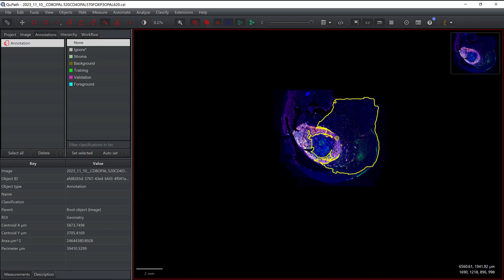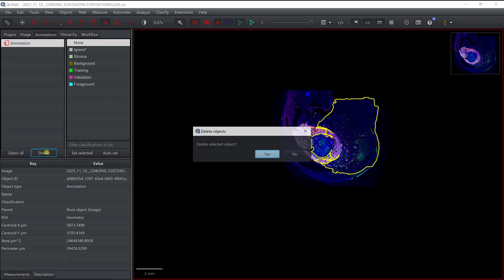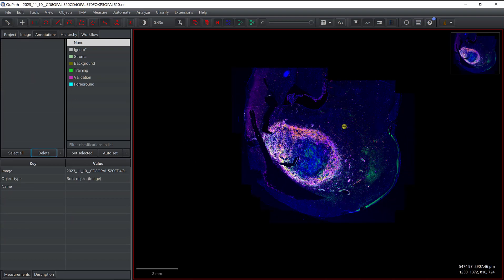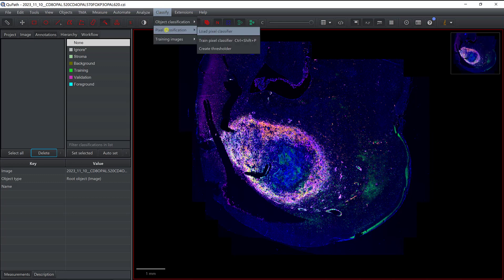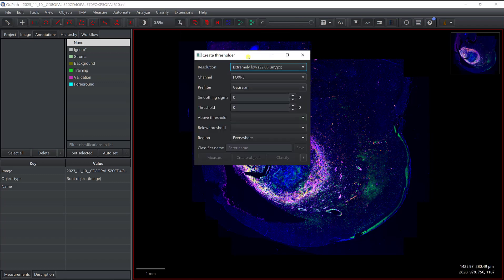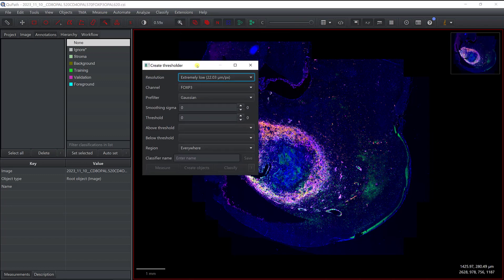I'm not going to do it that way. Instead I'm going to use the thresholding tool, so I'm going to remove the annotation and use the thresholding tool. It's actually defined as pixel classification, so if I go to Classify and then Pixel Classification I can create a threshold.